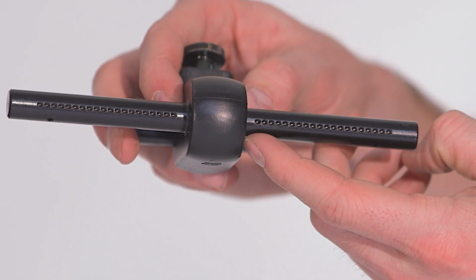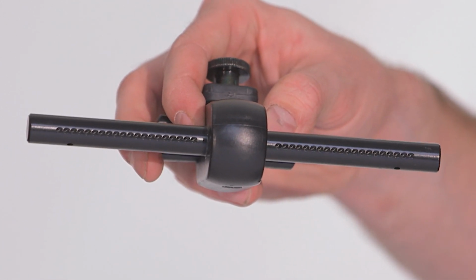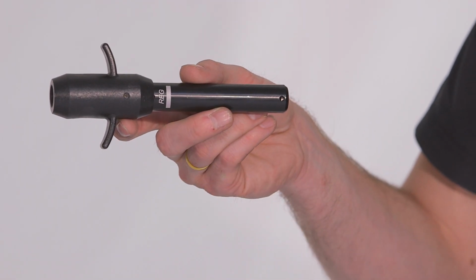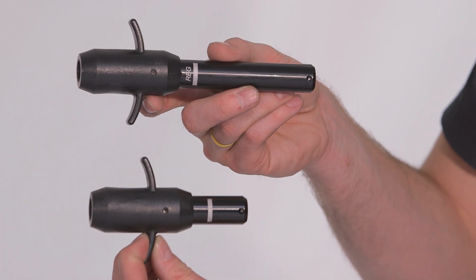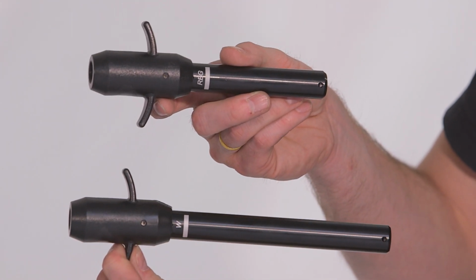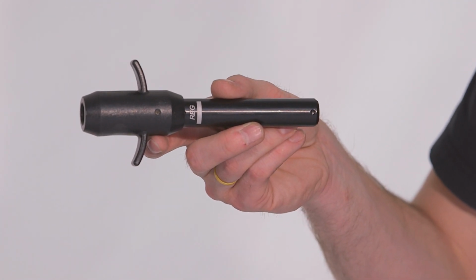On the back of these attachments, you will notice many dimples that the folder adapter end tubes engage, while also helping for quick setup. There are 3 adapter end tube sizes used for the many different folding frame chair widths. A majority of the time, the regular bar will be used, which is labeled so that you can decipher it from the narrow and the wide ones. Refer to the chart and the folder adapter bar mounting instructions for the end tubes that are typically used for the range of wheelchair widths.